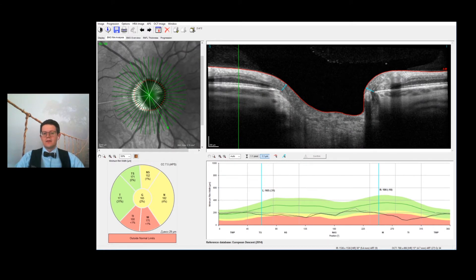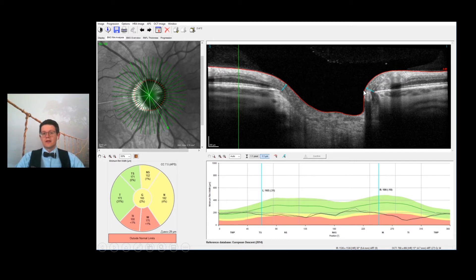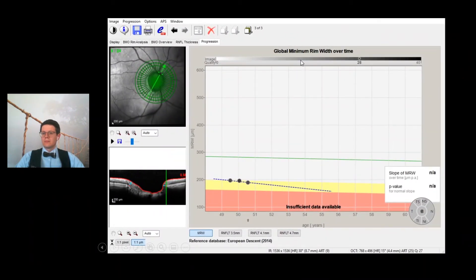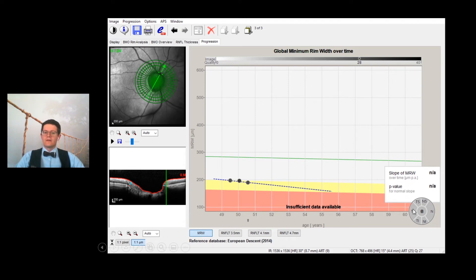In the analysis window you can easily see the progression for each measured position. R is right and L is left. The exact value in microns is shown for today's examination, and in brackets you can see the difference to the baseline examination. Using the progression tab gives you a continuous regression line combining all points from different data when you have fewer than five measurements. You can always switch between all sectors or each individual sector of interest.